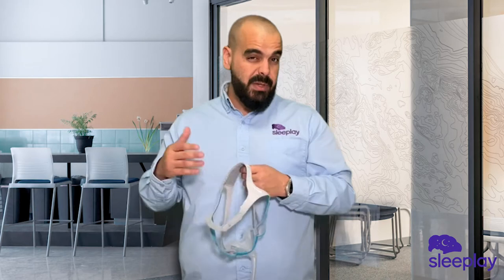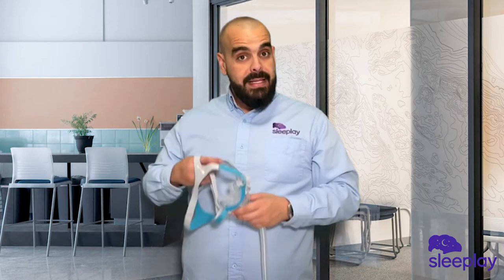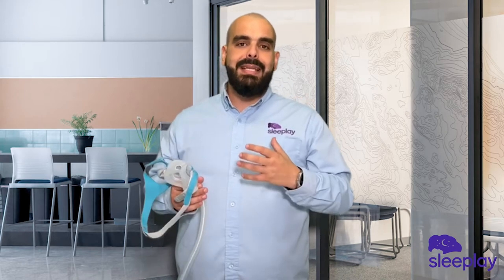For new users, especially side sleepers, you might want to think about a mask where tubing comes to the top of the head. But this is a great mask for people having problems with the bridge of the nose getting very sensitive, and it's an excellent choice for anyone who has problems with anything blocking their vision, like braces on the forehead.